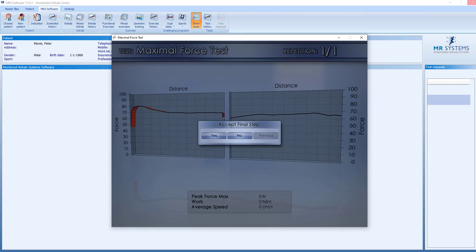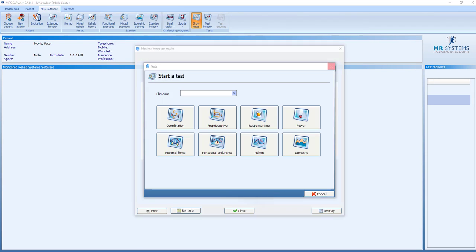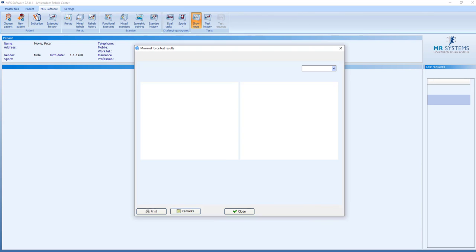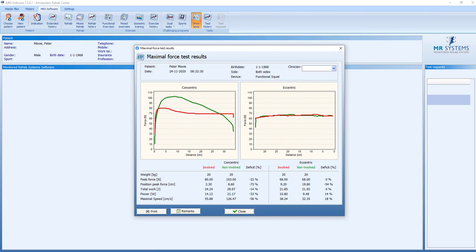So we have one repetition on the involved and one repetition on the uninvolved side. And those will be compared. In the graph, we look at the concentric. Eccentric is not important in this test.